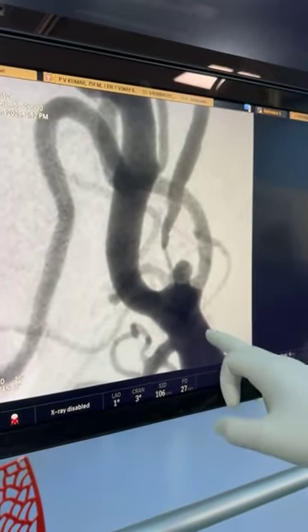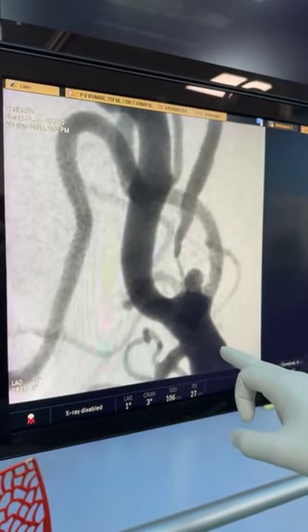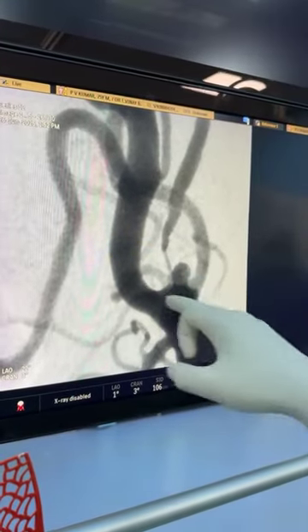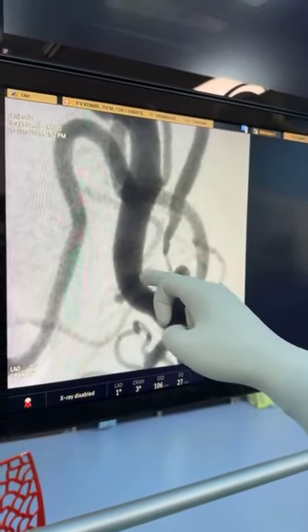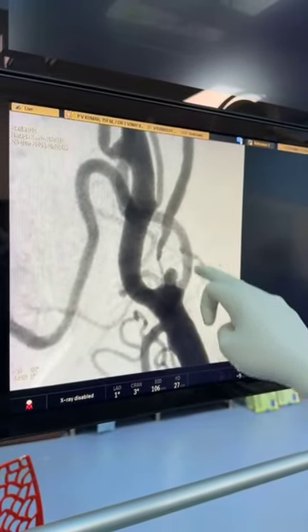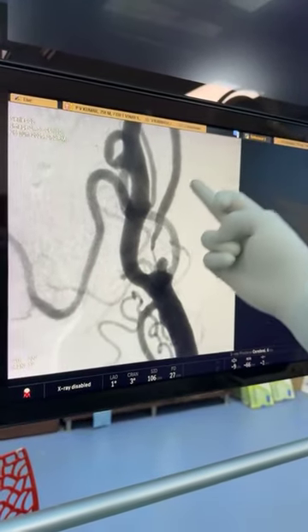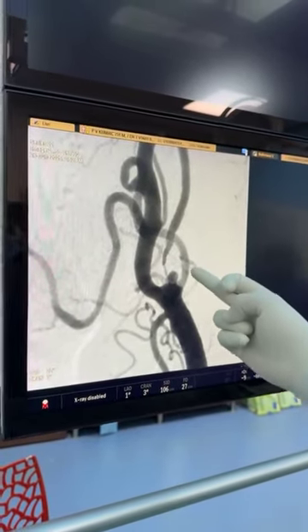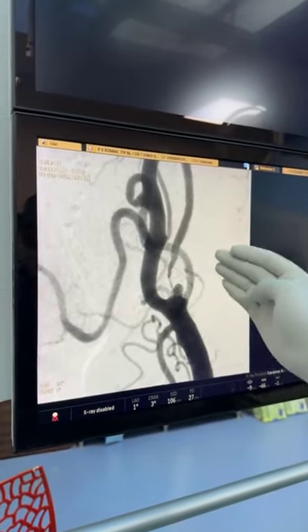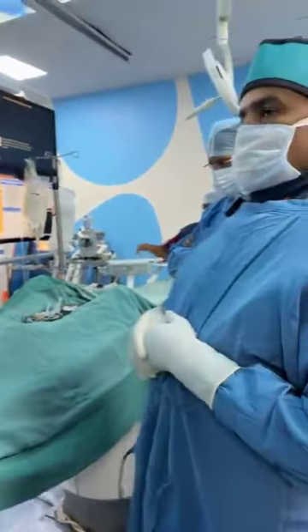This is the common carotid artery, which is coming from the heart, on the left side. There are two carotid arteries, one on the right and one on the left. This is the left carotid artery, which divides into two. One is going into the face, which is looking okay. One is going inside the brain. You see that it has become very, very narrow, with a little bit of dilatation. Because the blood vessel has become so thin, the reduced blood supply is causing hemodynamic stroke in this patient.